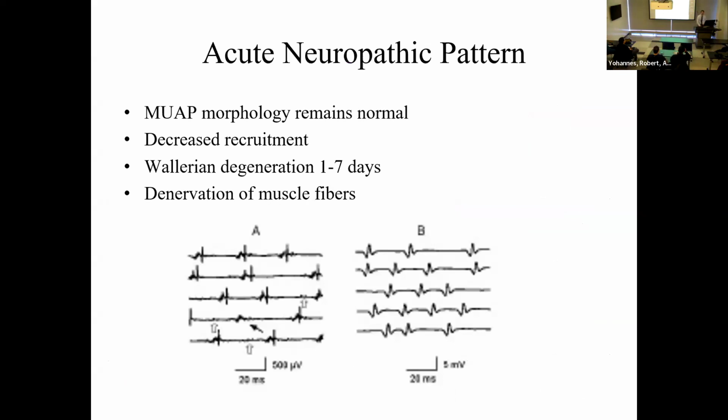Okay, when we have a neuropathic pattern, that's the situation where we have a loss of axons or loss of motor units. The remaining motor units have to provide, if they can, as much force as they can. So obviously, if there's a lot of loss of motor units, the patient will be weak, but hopefully not paralyzed initially. So why are they not paralyzed?